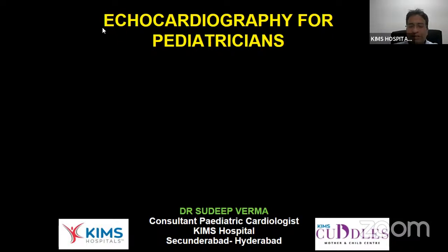I'm Dr. Sudeep, consultant pediatric cardiologist, KIMS Cuddles as well as KIMS Kondapur. Today we will cover what the pediatrician and neonatologist need from echocardiography. I'll share the presentation for half an hour, then we'll go to the bedside to see the views and how to assess other things. I'll go fast because we need to see the live patient also.